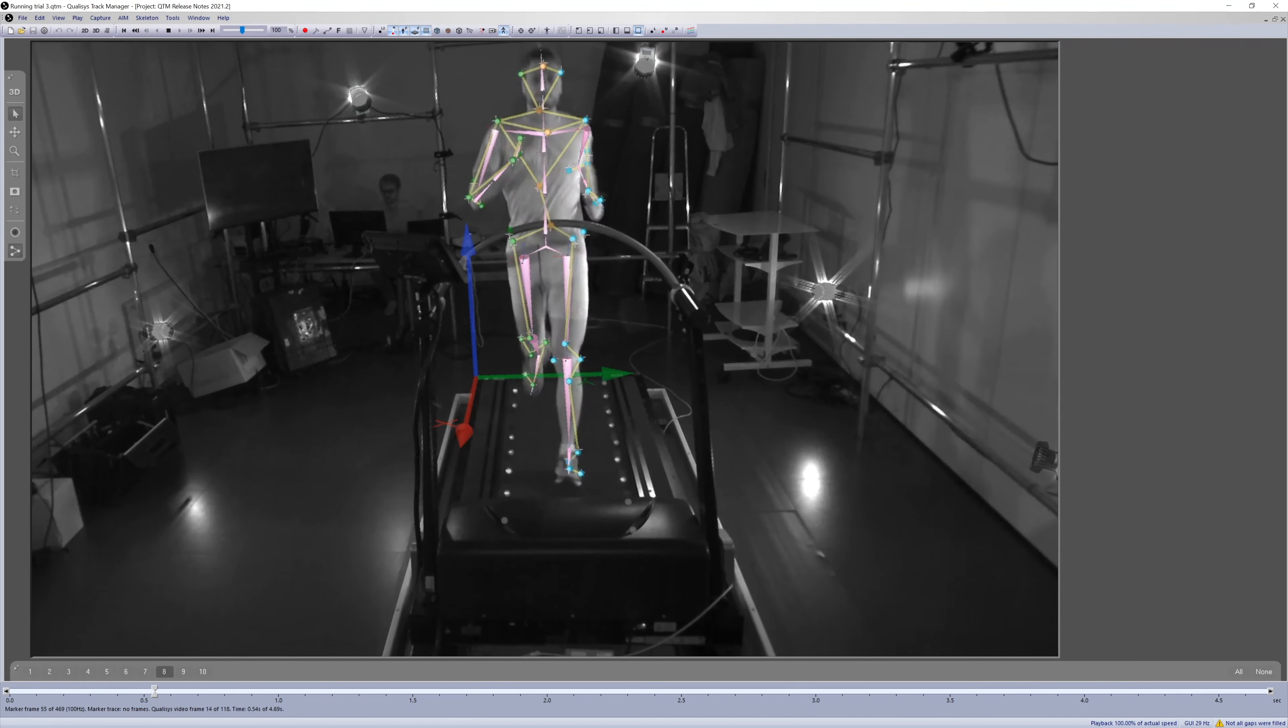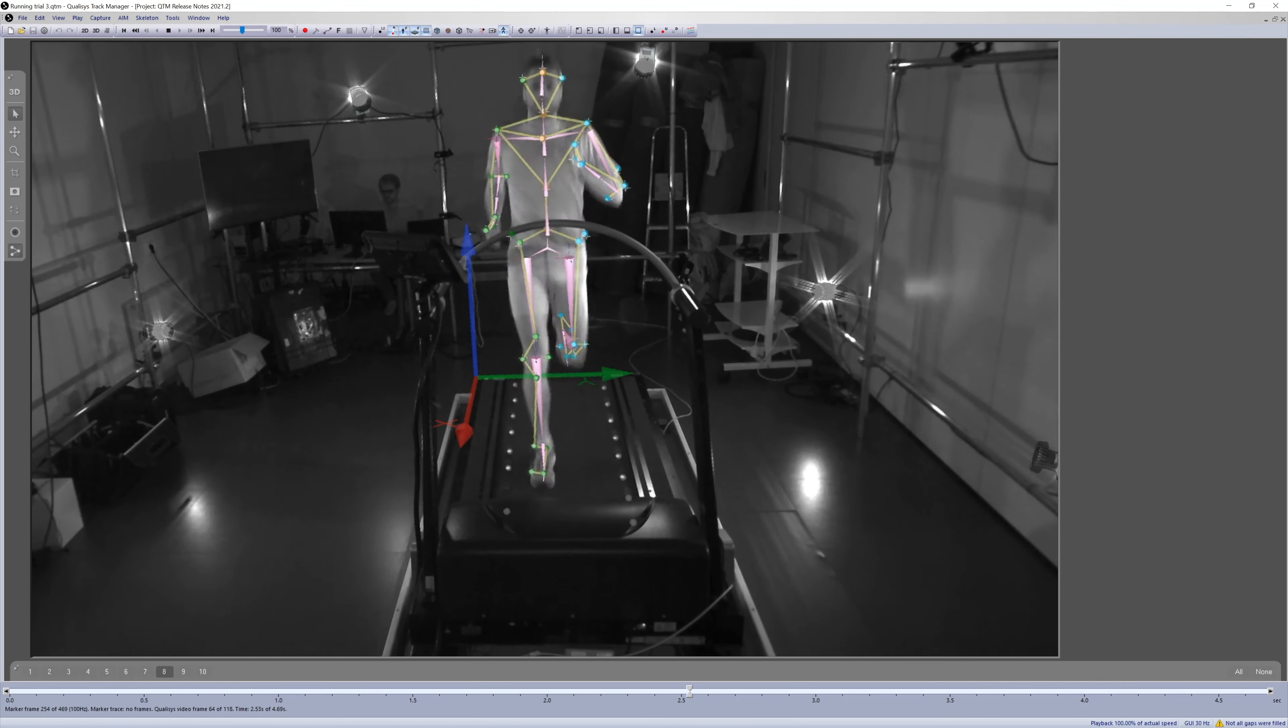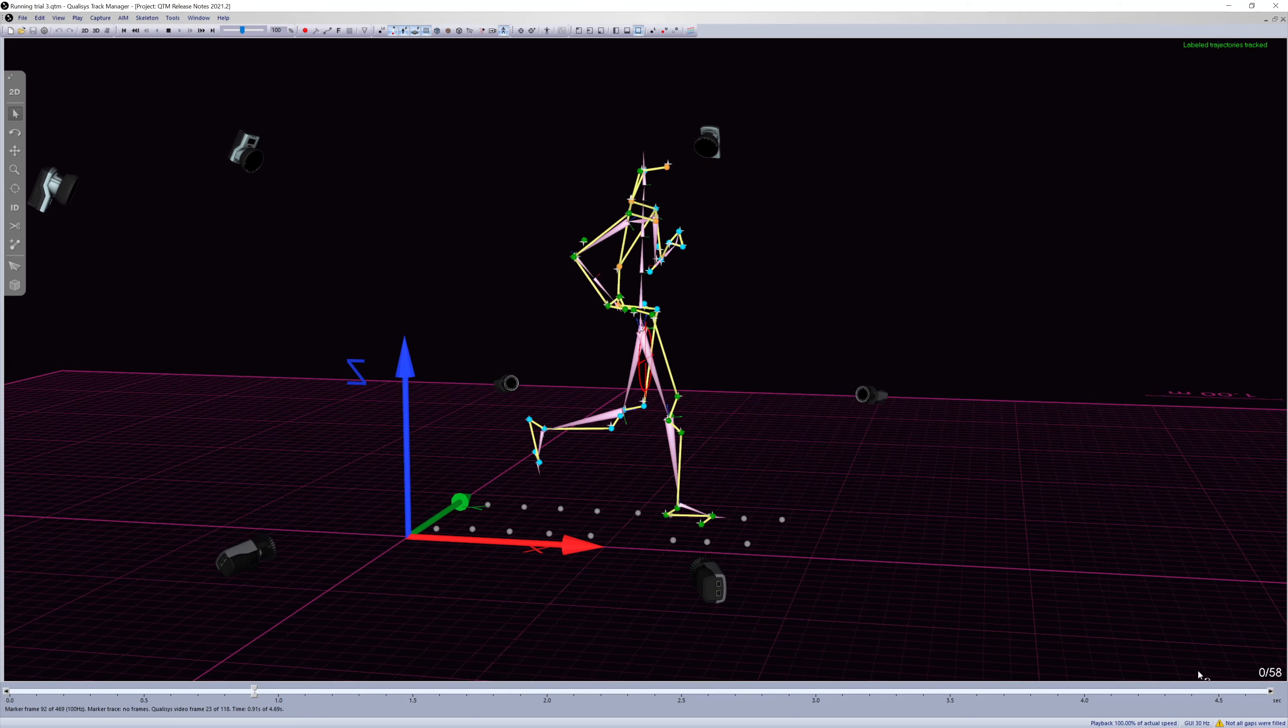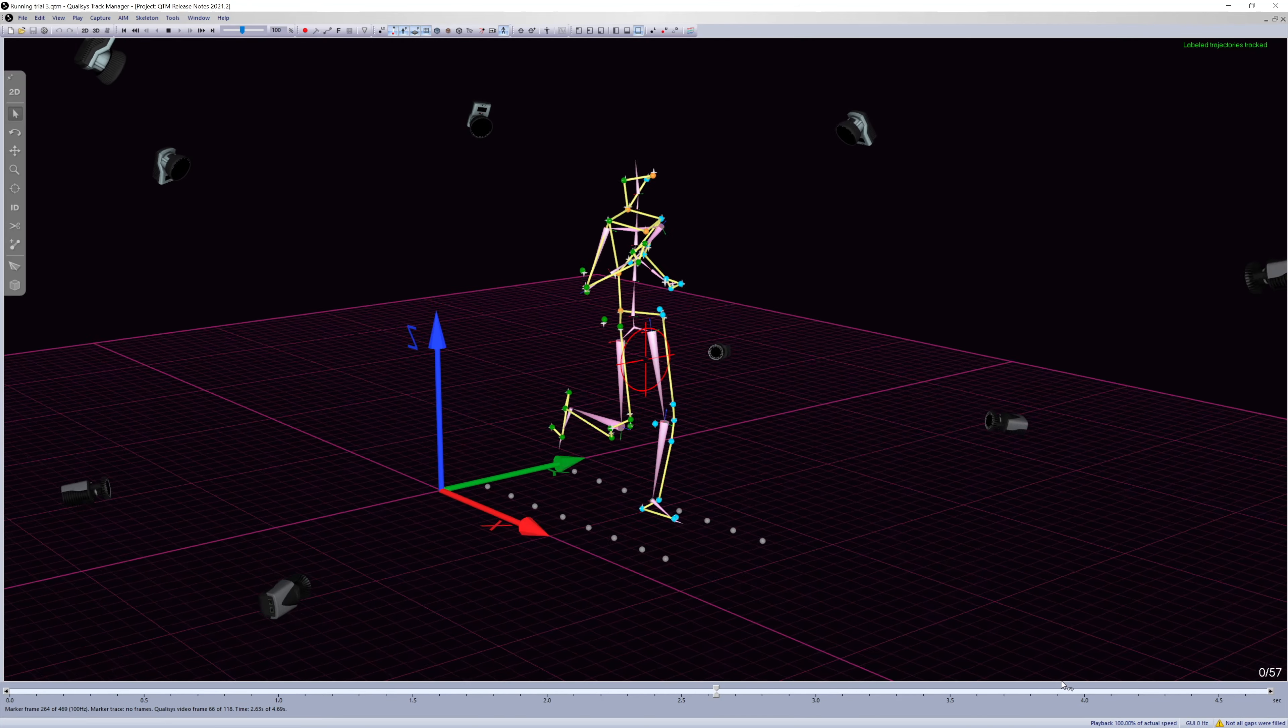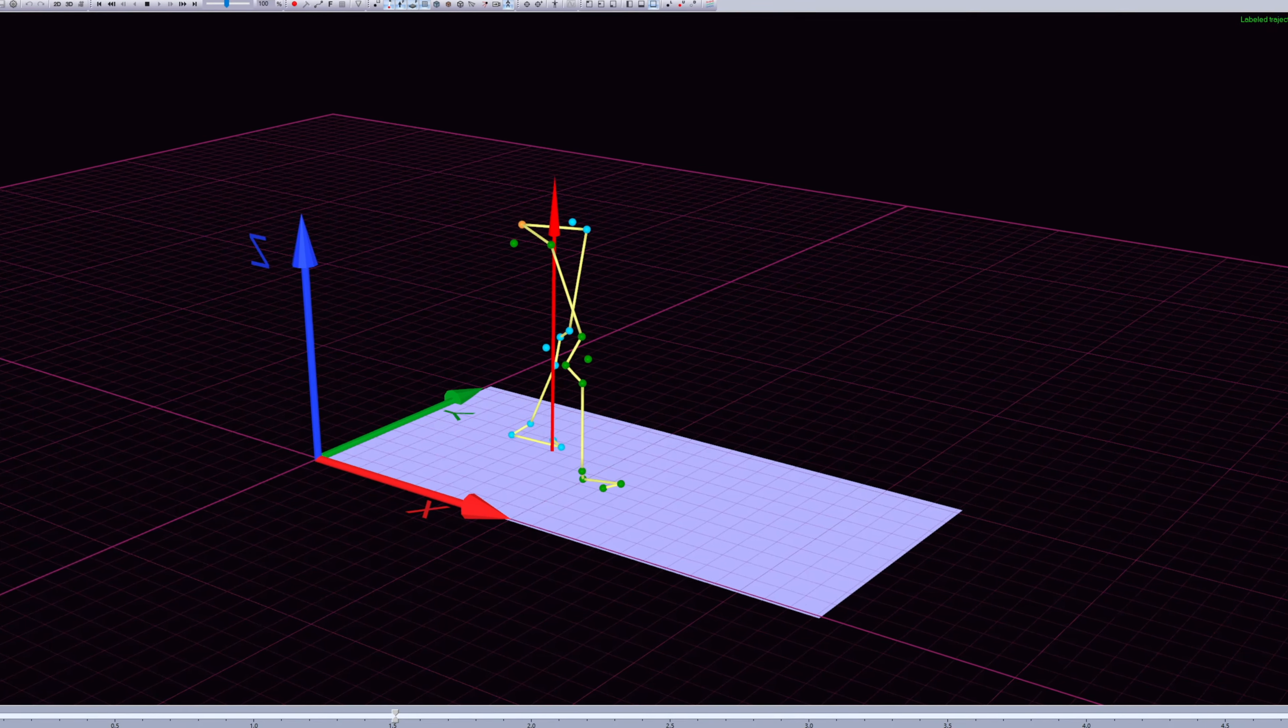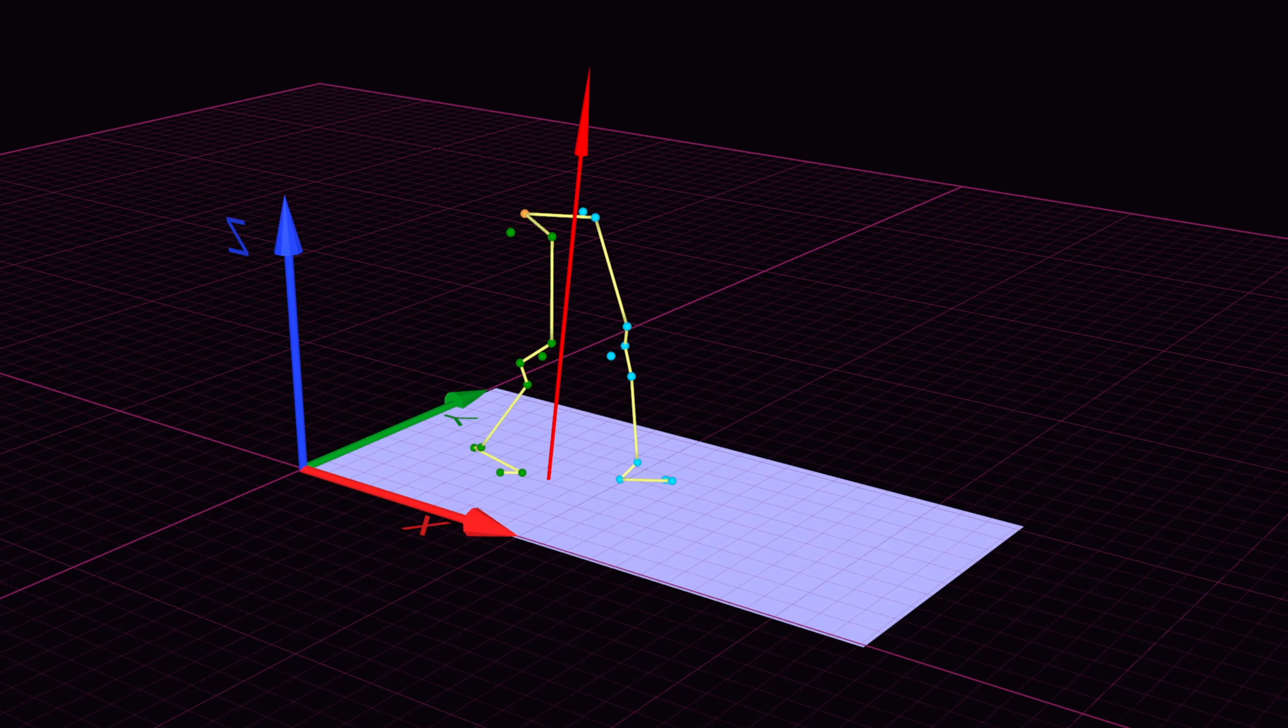The latest release of QTM supports the Gateway 3D Instrumented Treadmill made by HP Cosmos and Arcelis. The integration synchronizes the forces from the treadmill with the motion capture data in QTM.